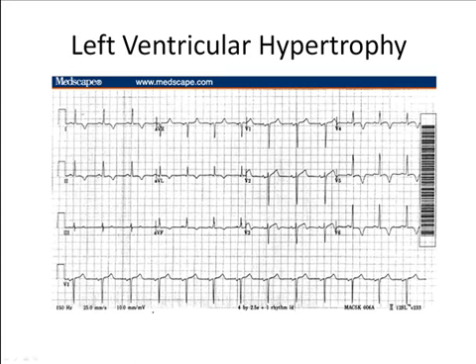Here we see ST elevation in the septal and anterior leads, but closer evaluation reveals an ST mimicker, left ventricular hypertrophy. V2's S wave shows 20 millimeters of amplitude, while V6's R wave shows 16 millimeters of amplitude. This patient would warrant every treatment modality as a STEMI except no cath lab activation. So in short, this is a potential cardiac event, just not a STEMI.